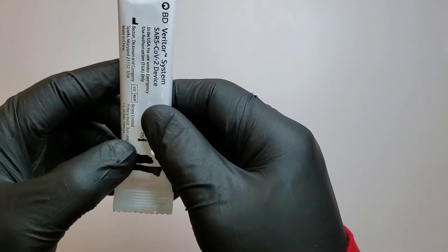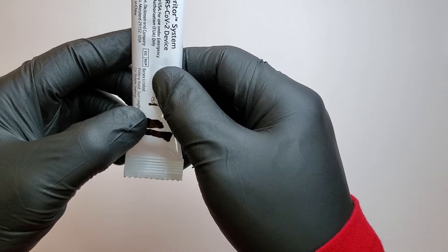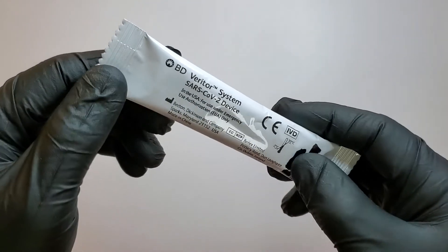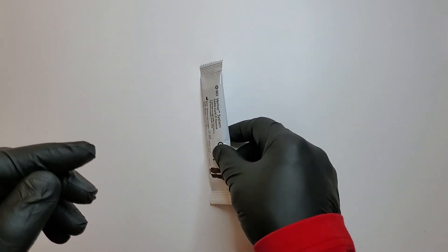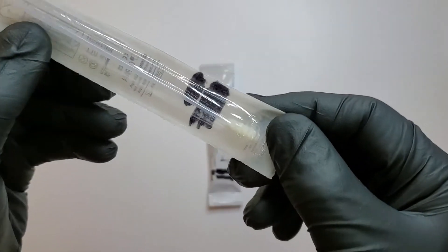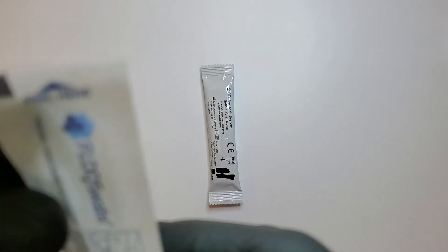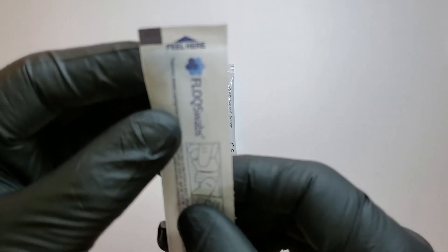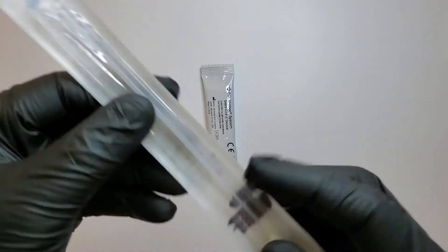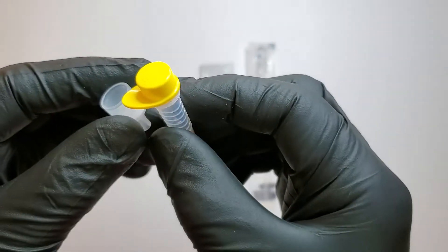So when you open the kit, you will see the Veritor System SARS-CoV-2 device — or I like to call it the analyzer. Then you will also get a nasal swab. It says 'seal here' to open it, like this. The nasal swab, and also the extraction tube.